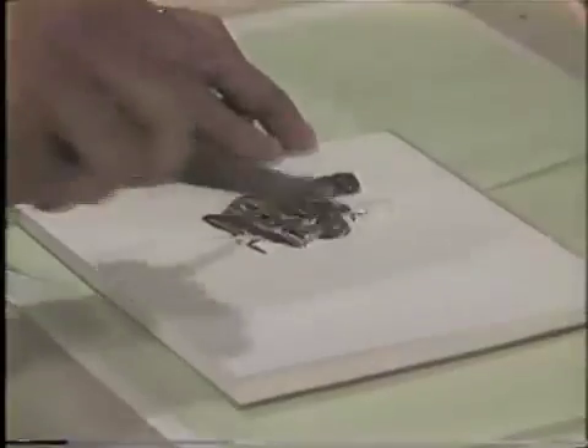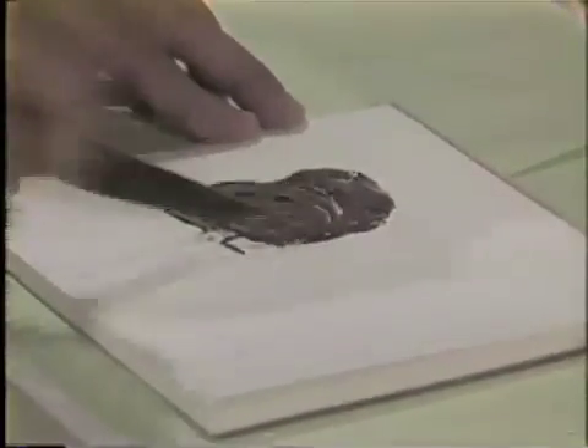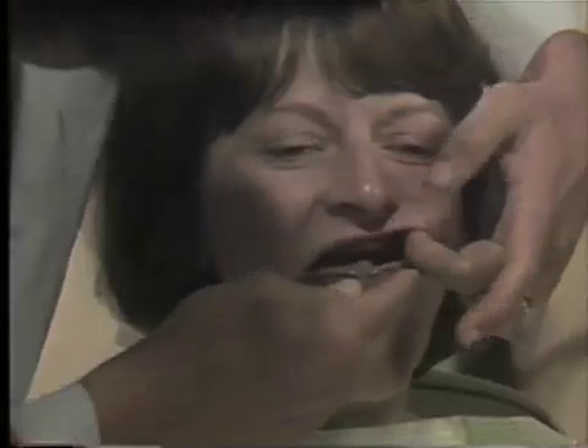Mix approximately two inches of light-bodied rubber base accelerator with the same amount of light-bodied base material. Distribute the impression material evenly in the denture, being certain that some of the impression material covers the border of the denture. Place the denture evenly in the patient's mouth.